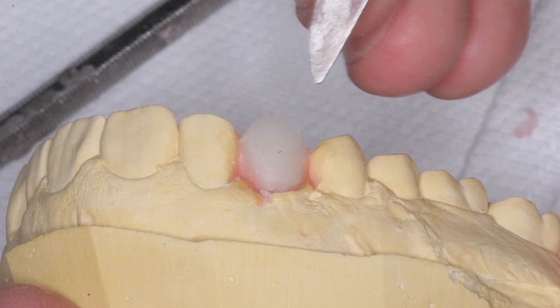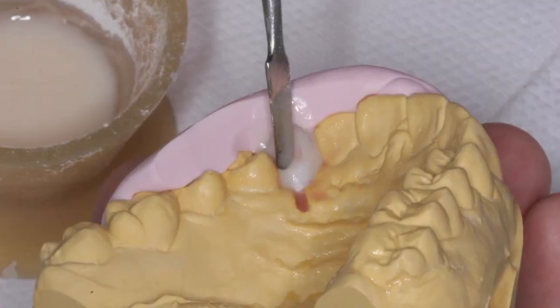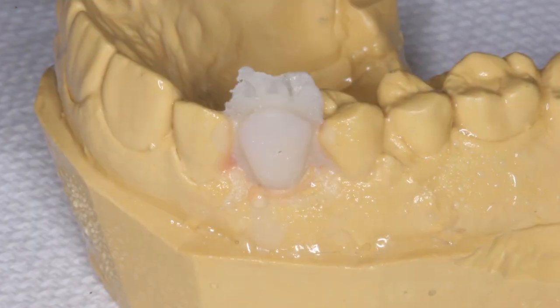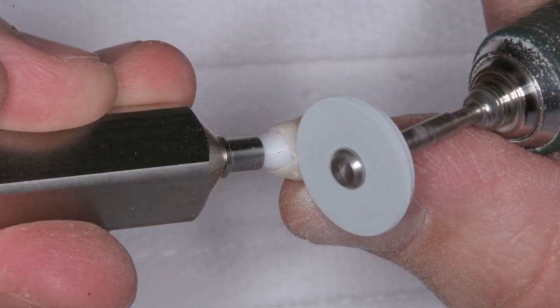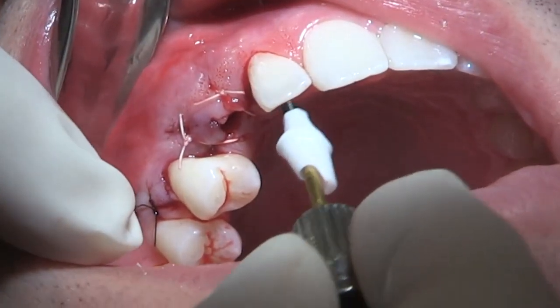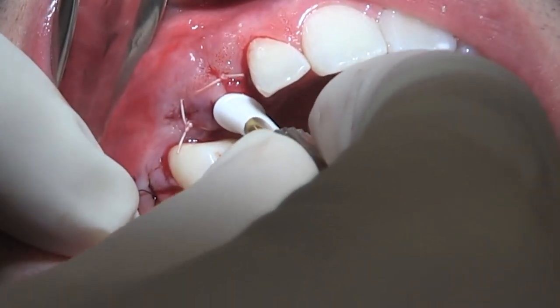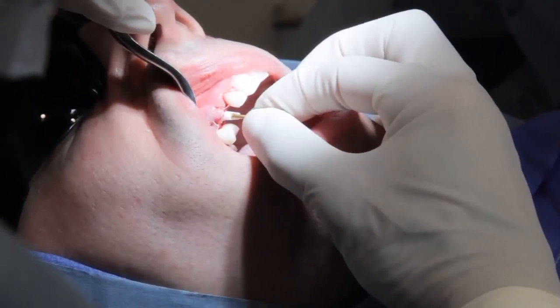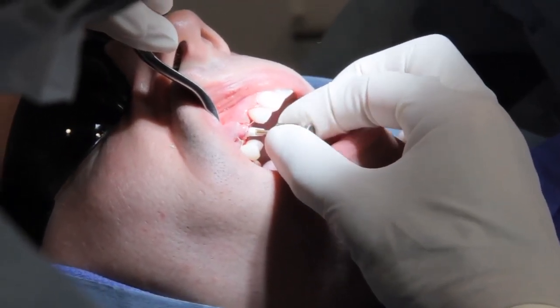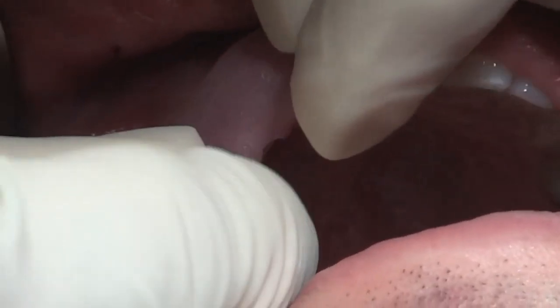Here you can see the steps which were followed to modify the zirconia abutment and to fabricate the temporary crown in a professional laboratory in a few hours after the implant was placed. From there, the abutment and temporary crown come back to the office and the healing abutment can be removed and the abutment inserted. The abutment is carefully inserted not to traumatize the tissues and to be very precise in its location.